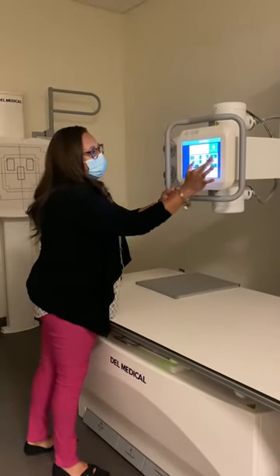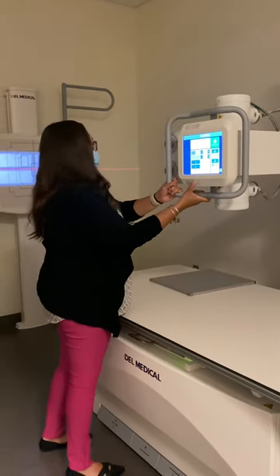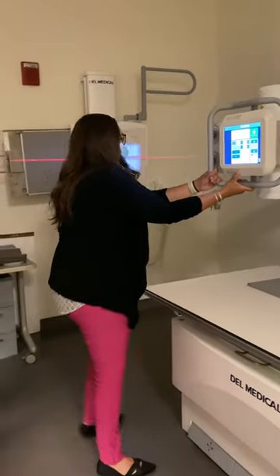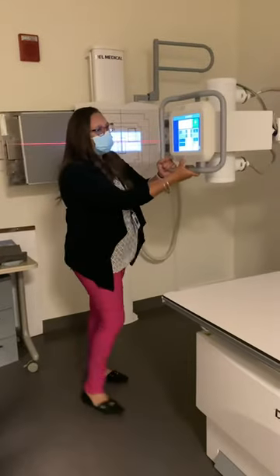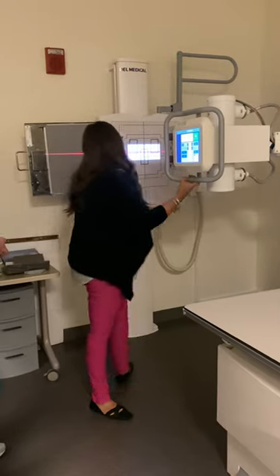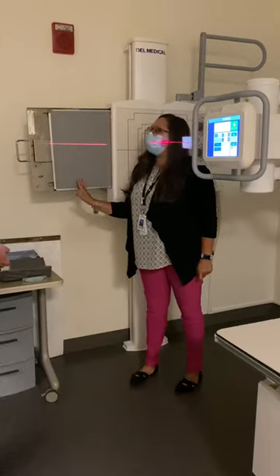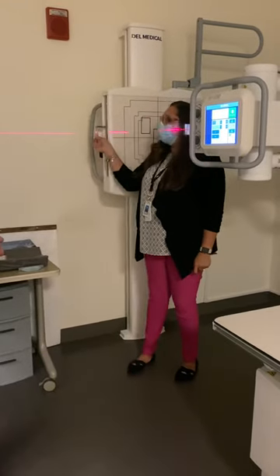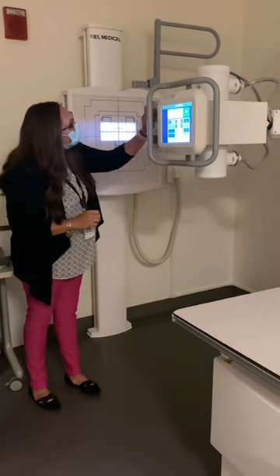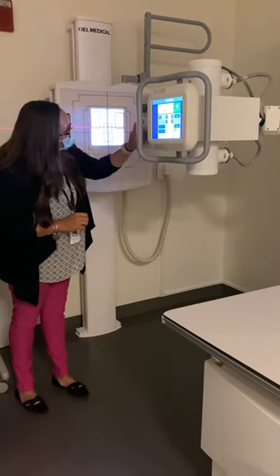We're going to do these upright. Make sure that I'm in transverse detent and a 40-inch FID. My film can go in either way, 14 by 17 crosswise or lengthwise. We're going to use 10 by 12 collimation lengthwise for both the AP and the lateral scapula. I'm going to change my collimation to 10 by 12.